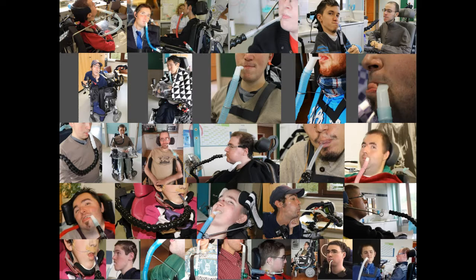I told you we started mouthpiece ventilation in '91 already, and you see here many patients where we have implemented mouthpiece ventilation, and you see that every patient has a different system.